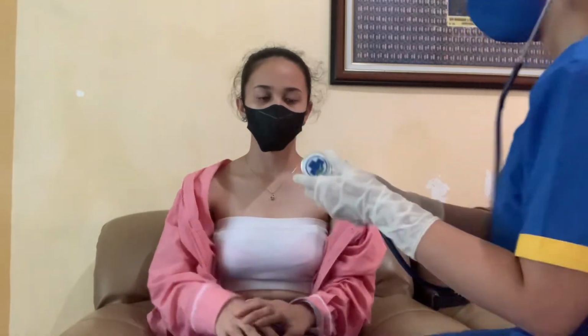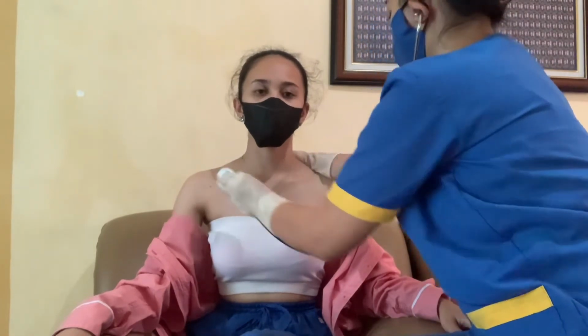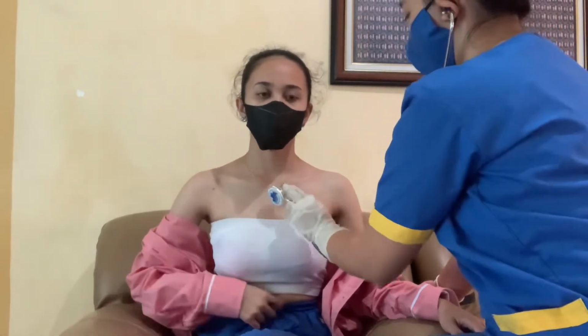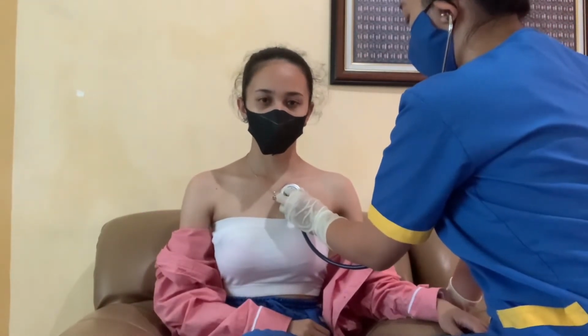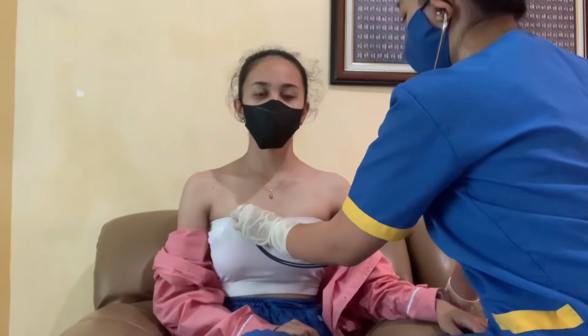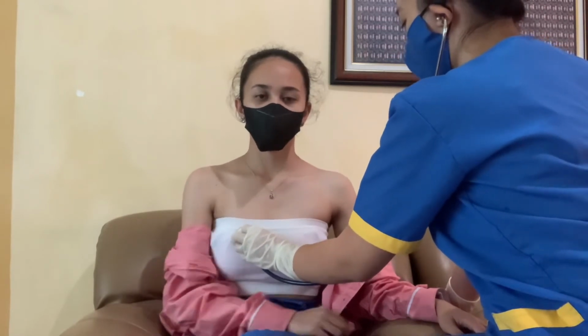After using the diaphragm, use the bell and start again from the first intercostal up to the lower lobes. Inhale, exhale. Second intercostal, inhale, exhale. Third intercostal, inhale, exhale. Fourth intercostal, inhale, exhale.